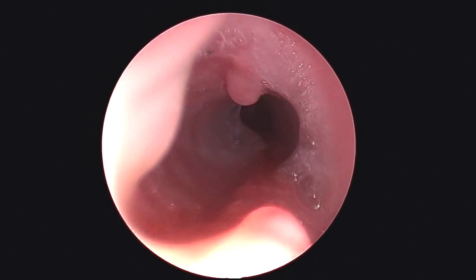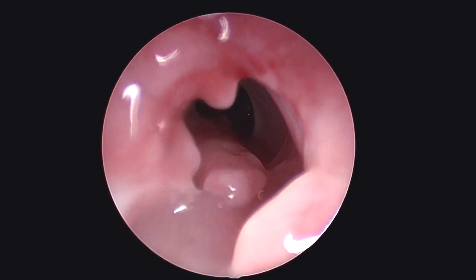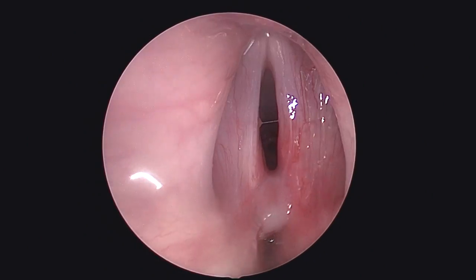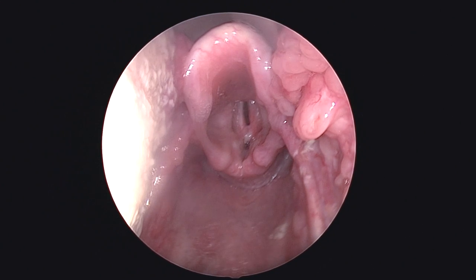This was a patient who came in with tracheal stenosis after an intubation injury. Here I'm doing the laryngoscopy and tracheoscopy, and you can see I'm in the trachea. Essentially she had a grade 3 stenosis in the trachea. She also had laryngeal stenosis — the posterior vocal cords had fused together.